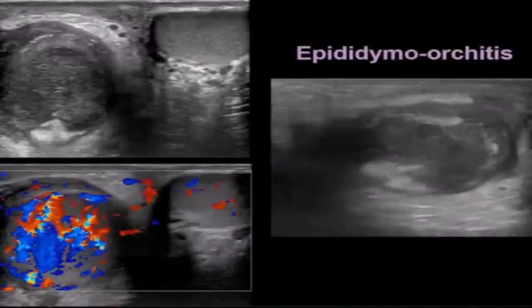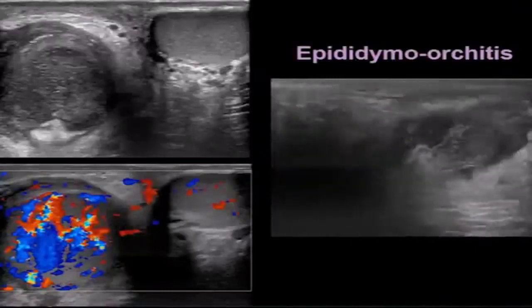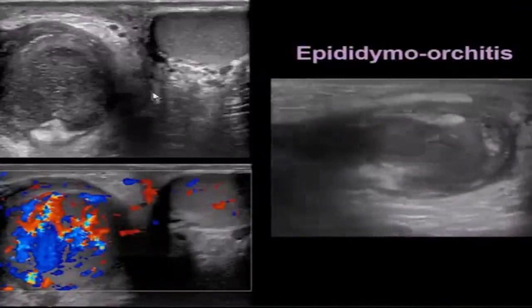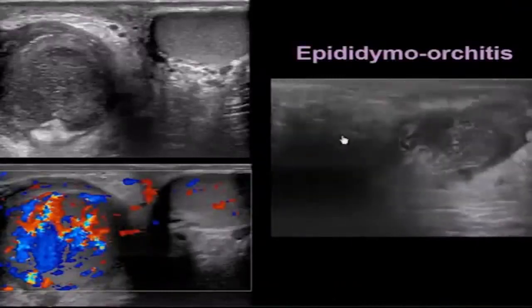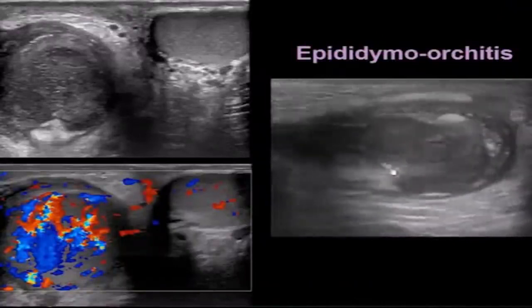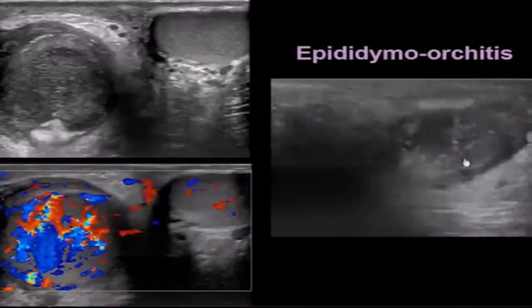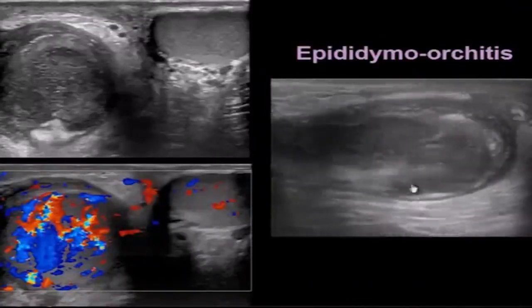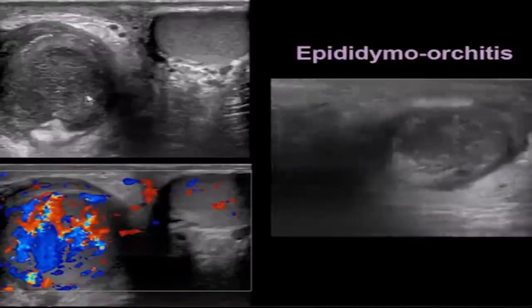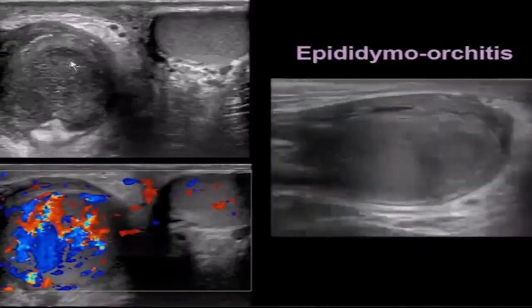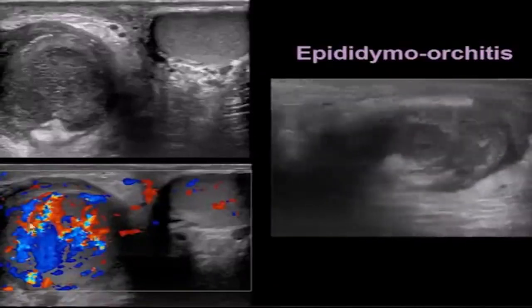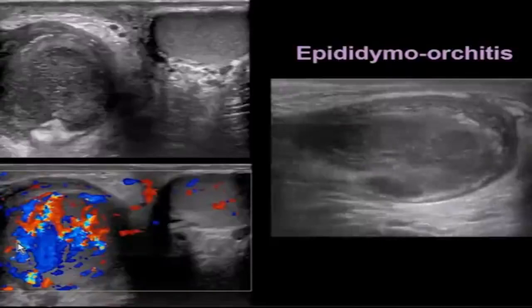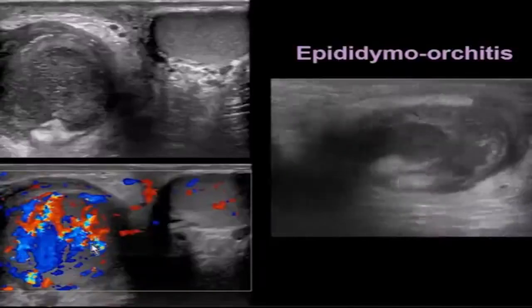Here's a patient with epididymoorchitis. You can see marked thickening of the epididymis, altered echogenicity in the right testicle on clip as well as on transverse view compared to the left, and marked increased blood flow inside the right testicle.